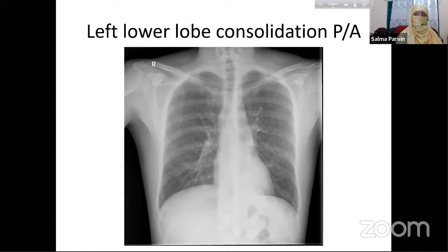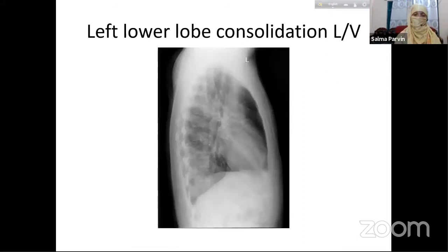So something else is present in the left paraspinal area, the left pulmonary lower zone, obscuring the paraspinal translucency, reaching to the left hemidiaphragm. And noted in the retrocardiac shadow is that again this translucency is less and less.